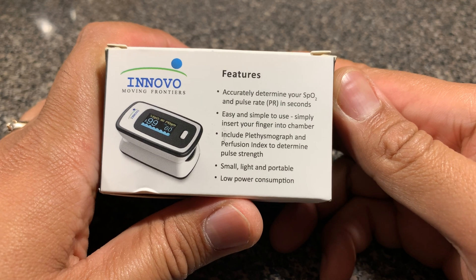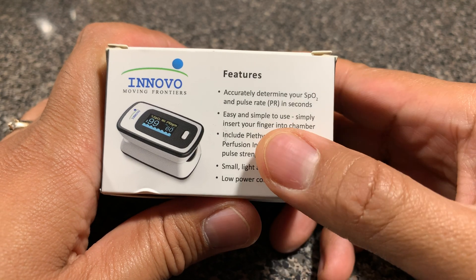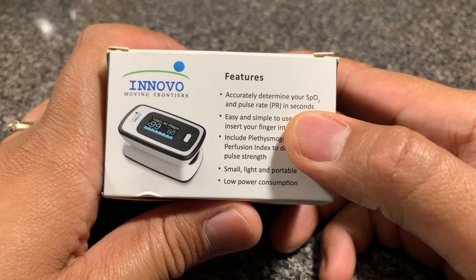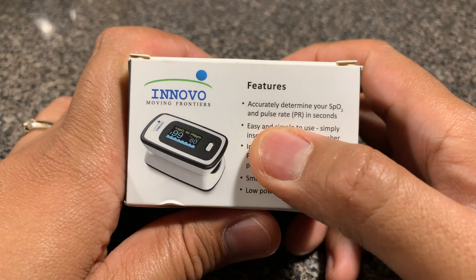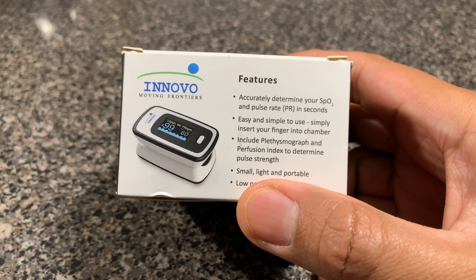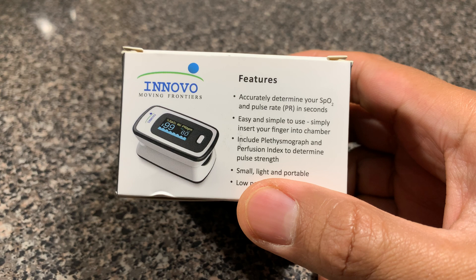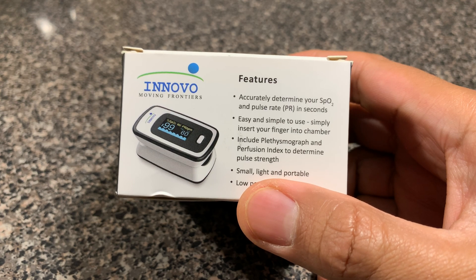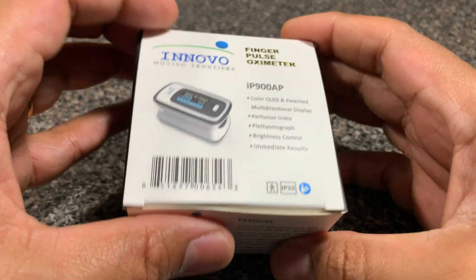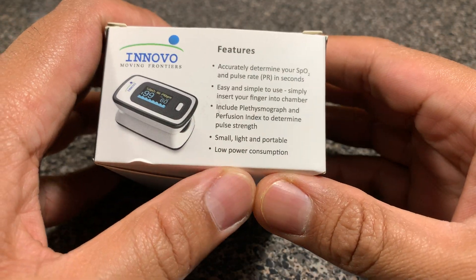Flipping around, it shows us the features: it accurately determines your SpO2 — which is basically the blood oxygen level — and the pulse rate in seconds. Easy and simple to use; simply insert your finger into the chamber. It includes the plethysmograph and perfusion index to determine pulse strength. It's small, light and portable, as you can judge by the packaging, and has low power consumption.